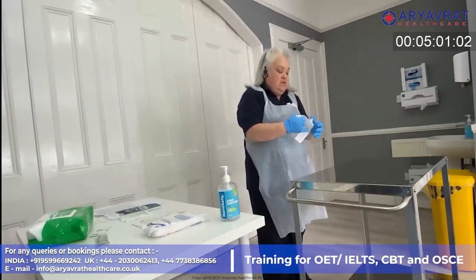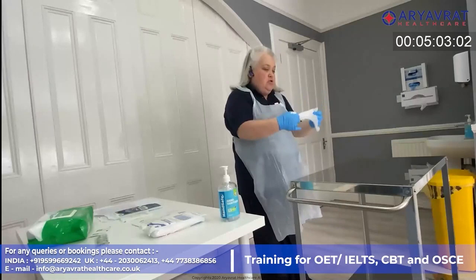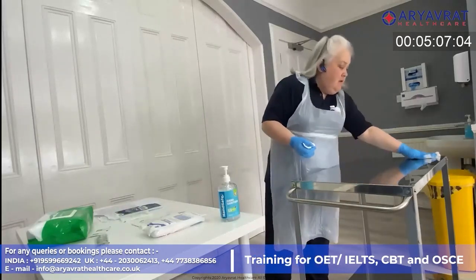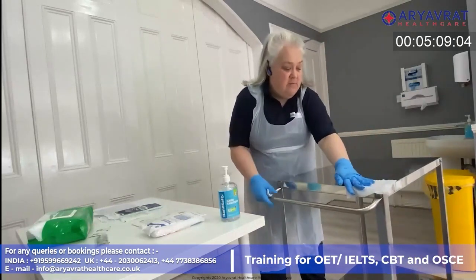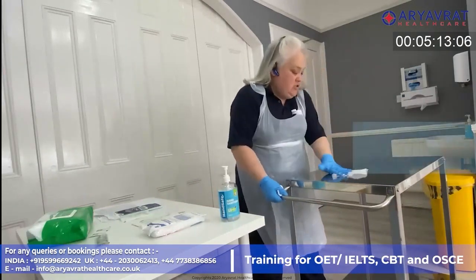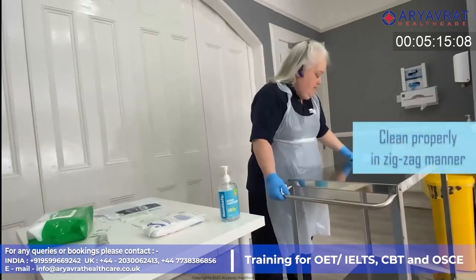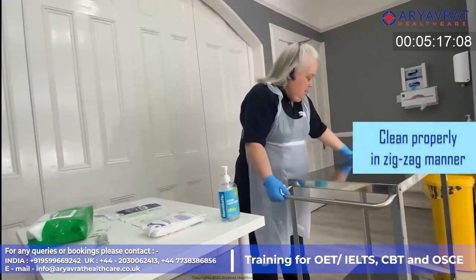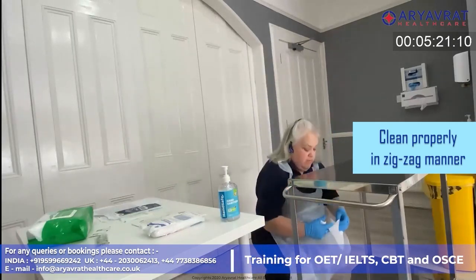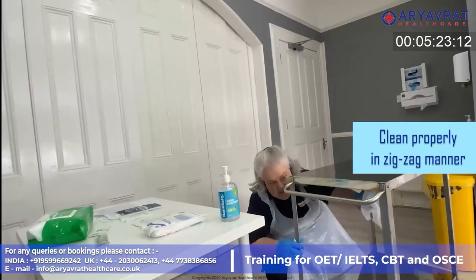and I am going to clean the trolley from top to bottom, from furthest to nearest in a zigzag manner. Okay, so starting at the back in a zigzag manner, making sure that I have cleaned thoroughly, and turning the wipe over, I am going to clean the back legs.